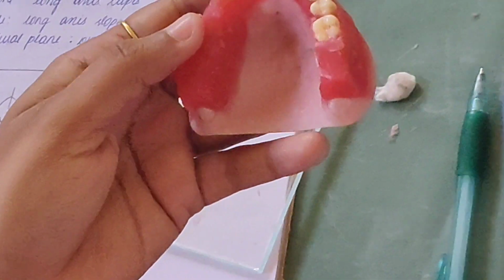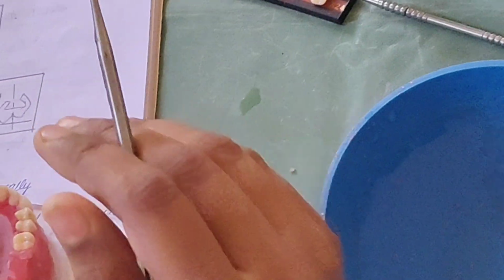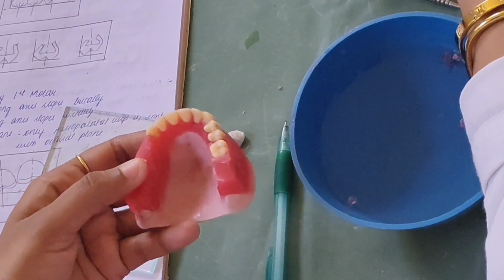I'll seal it and show you the relation. It is not very prominent, not too much above. Very slight, only a 0.5 mm difference will be there.